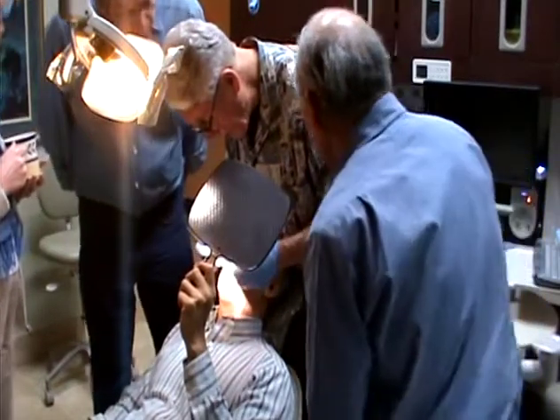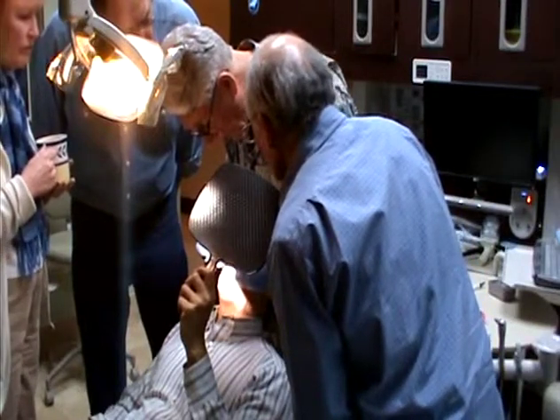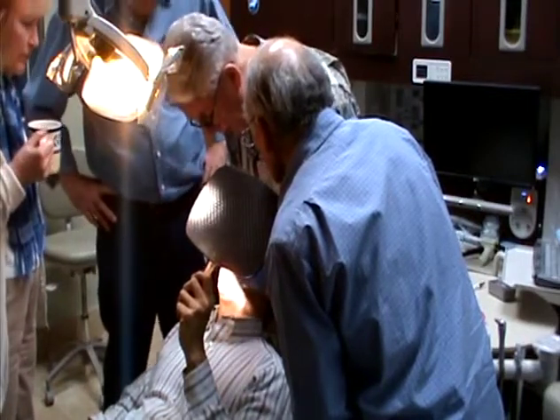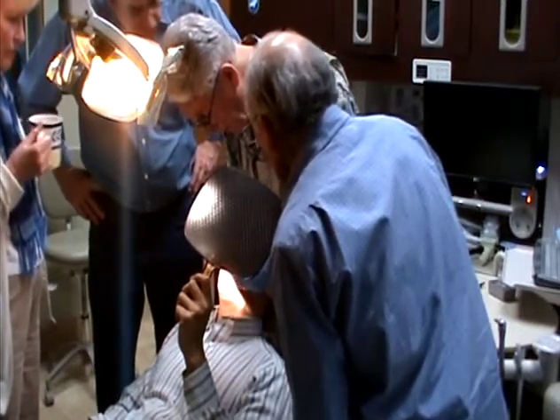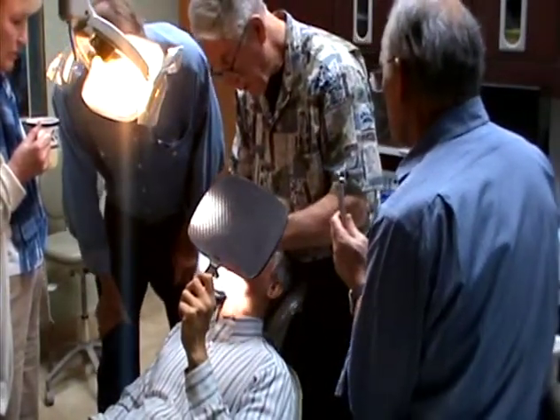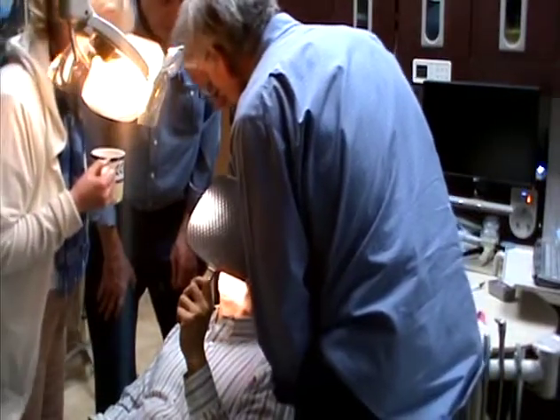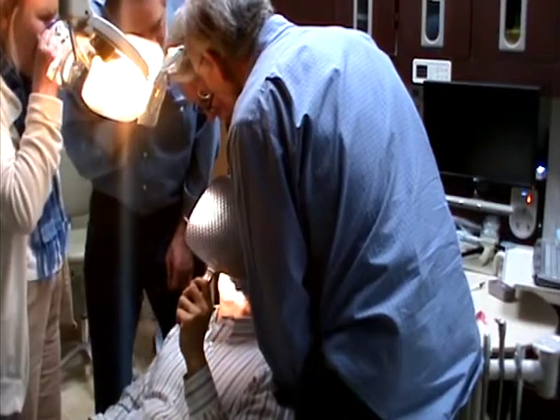See, when he bites down now, you've got to stop here, and you stop right on the corner of this molar. Right there, in the corner. But then when he slides up this little incline right here, and the stop is right here. Is it stop in red or green? That's in red. This little stop point right here, you want to keep that, right? There it is, right on the marginal ridge right here. Mm-hmm. Okay.